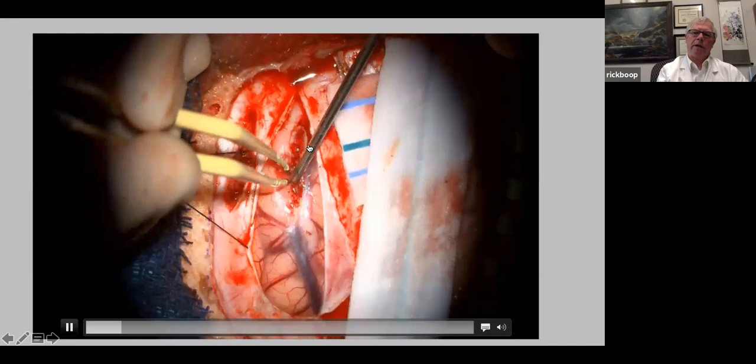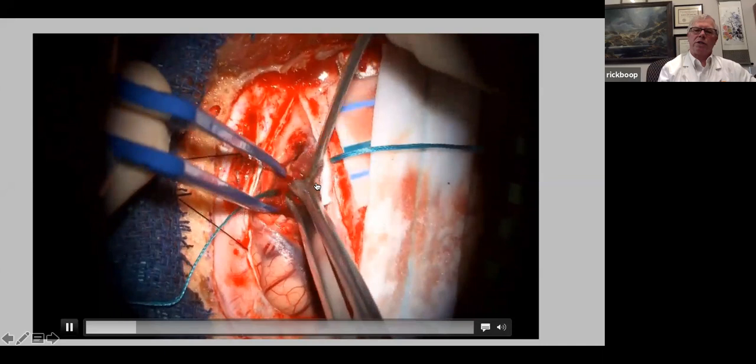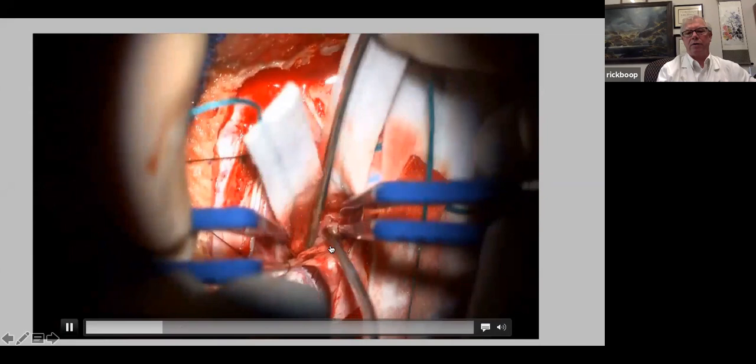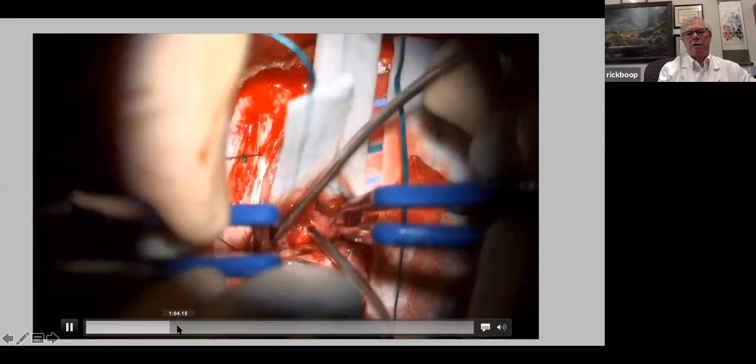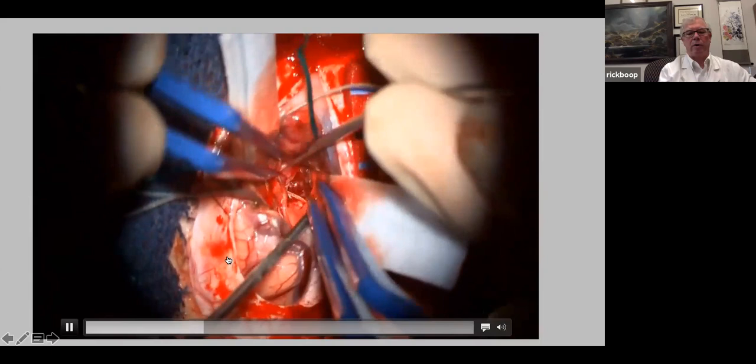So this is the Sylvian fissure. This is what normally you would say is frontal operculum, but this was tumor at the surface here. So getting into tumor, biopsy came back consistent with a high-grade glial neoplasm. And then identifying the Sylvian vessels as they come into the tumor anteriorly, and taking care to dissect out the perforators coming off of those vessels, taking the blood supply to the tumor, but preserving those vessels as we work through the tumor to resect it.